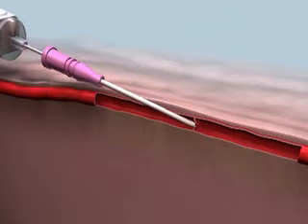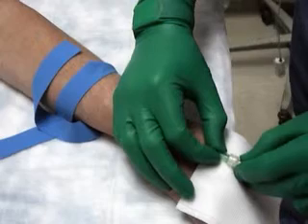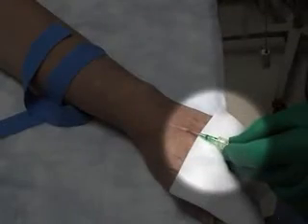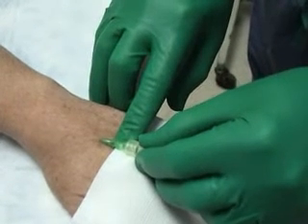A valve within the vein may prevent advancement of an inserted catheter. If this occurs, hold the cannula hub in place, remove the tourniquet, and connect the intravenous tubing to the cannula. Running fluid into the vein may open the valve and allow the cannula to be completely inserted.